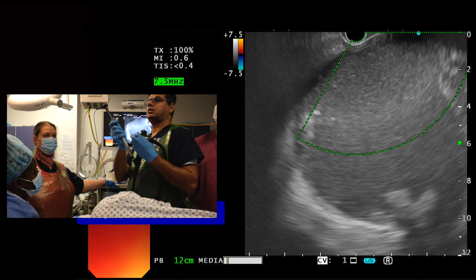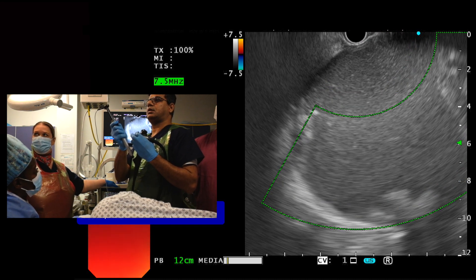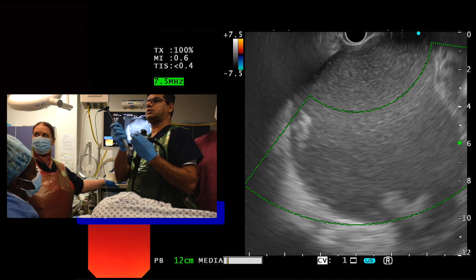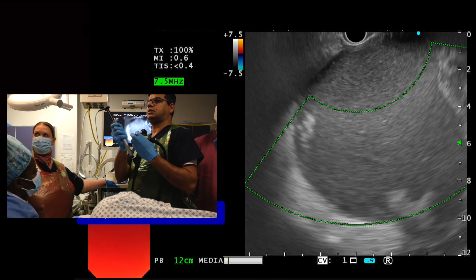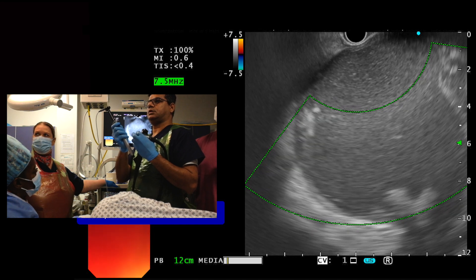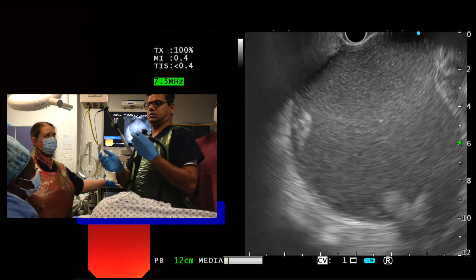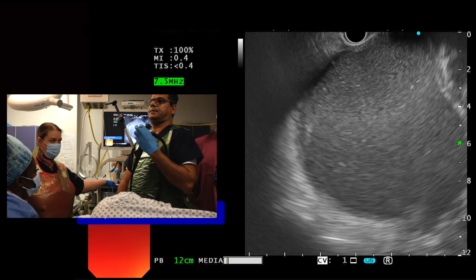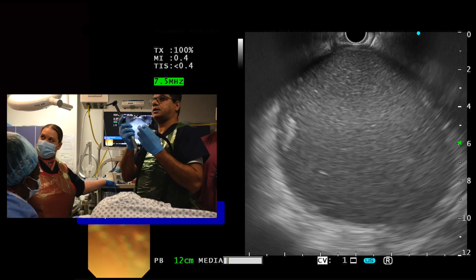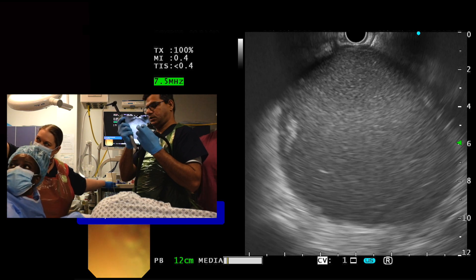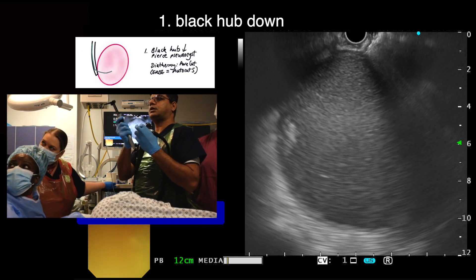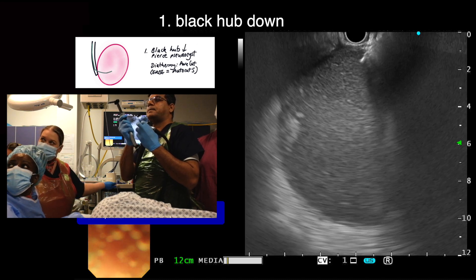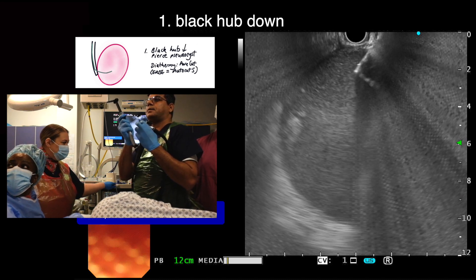Final checks are made with the Doppler to ensure that there are no blood vessels in the way or in the opposite cyst wall. We are now ready for action. The black hub is unlocked and under EUS guidance the black hub is gently pushed downwards with the diathermy on. The catheter can be seen piercing the wall of the cyst and is passed into the cyst for a distance of 3 to 4 cm.